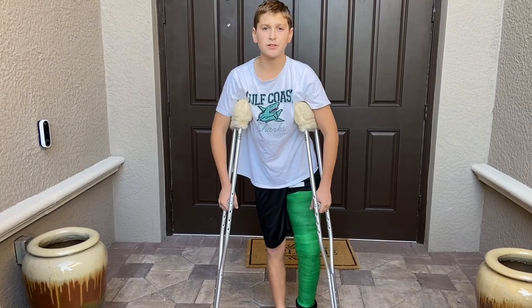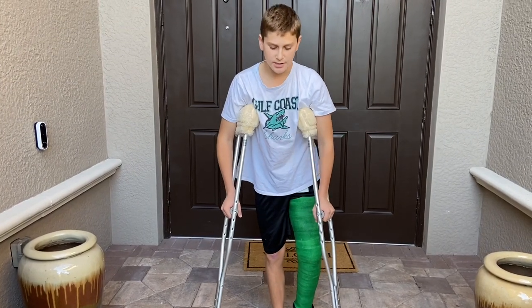Welcome to Jake Pediatrics. Today I'm going to be showing you how to get up and down stairs on crutches non-weight bearing.